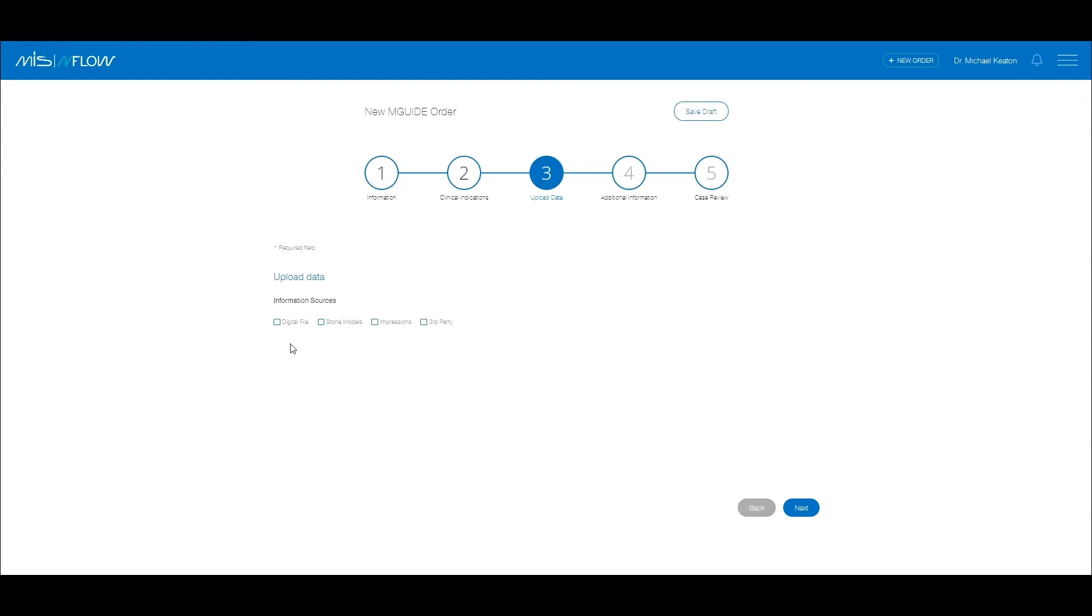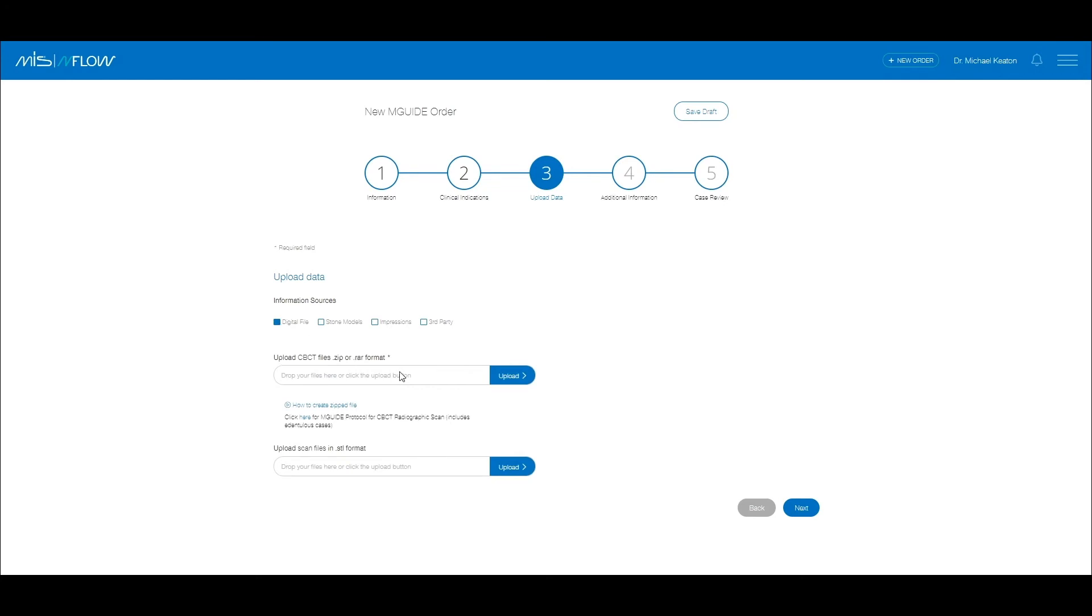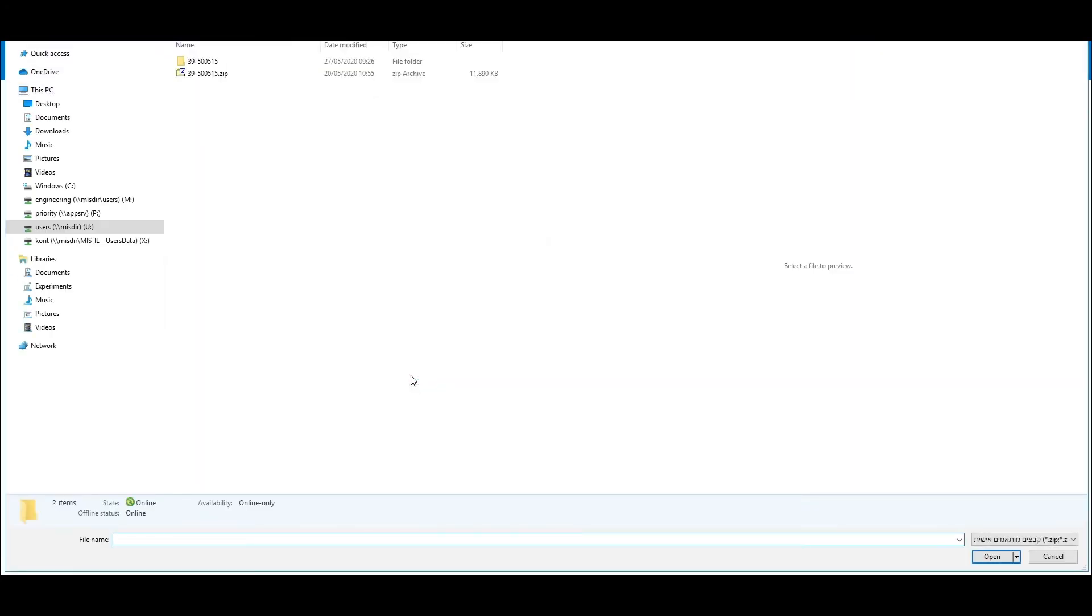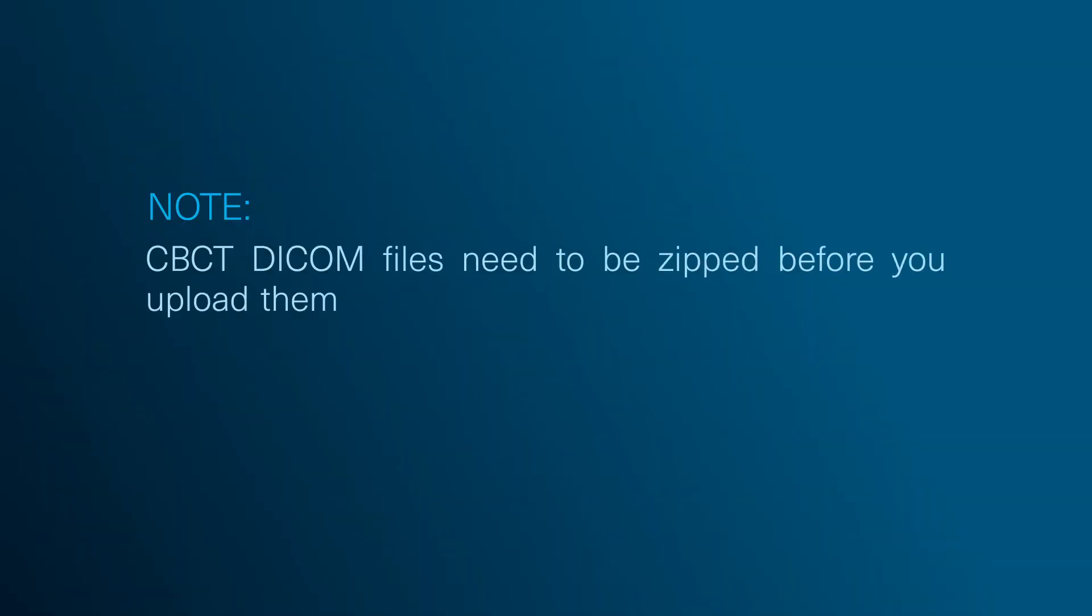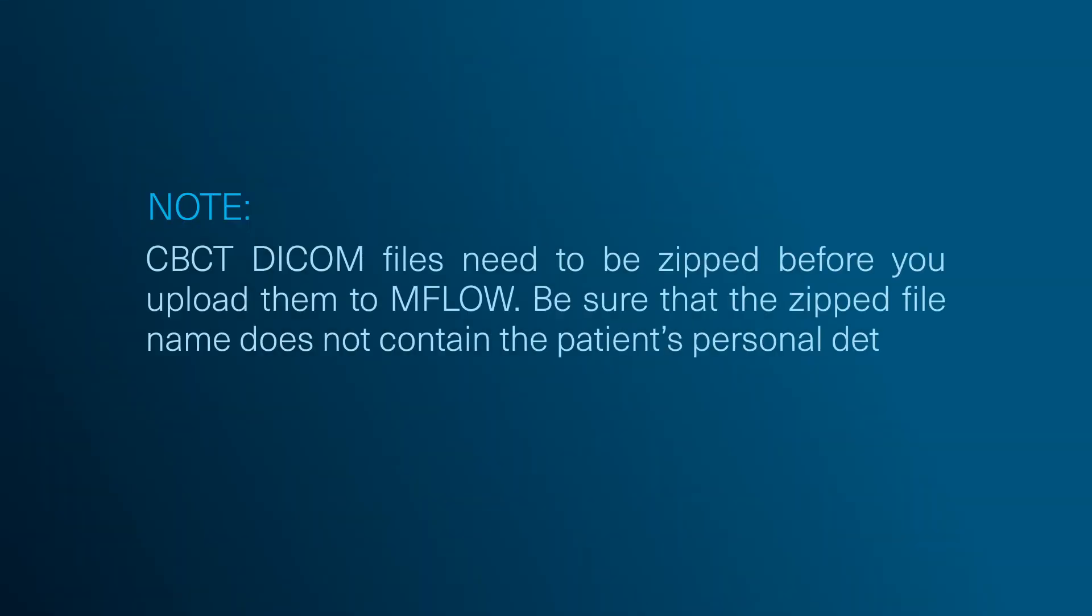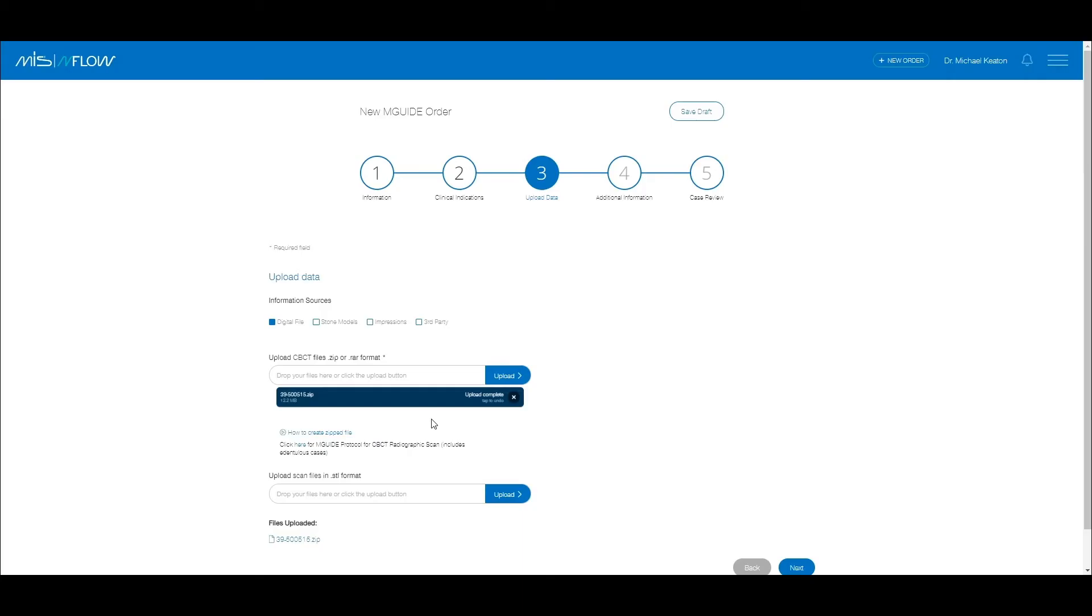This is the data acquisition page. If you choose to upload digital files, use the top upload bar to upload the CBCT file. After you upload the CBCT, continue uploading the scanned file in the second upload bar.